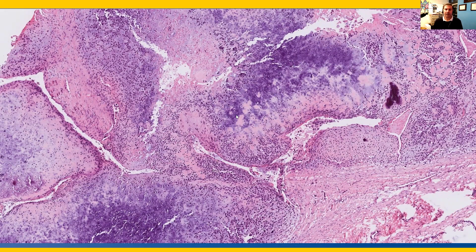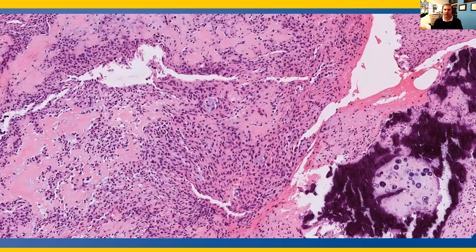The cells are haphazardly growing and have various areas of osteoid production. At higher power, we have areas of cartilage — these little nodules with the purple matrix mineralization pattern of osteoid. Cells are haphazardly growing with this pink osteoid matrix, and this is a chondroblastic osteosarcoma.